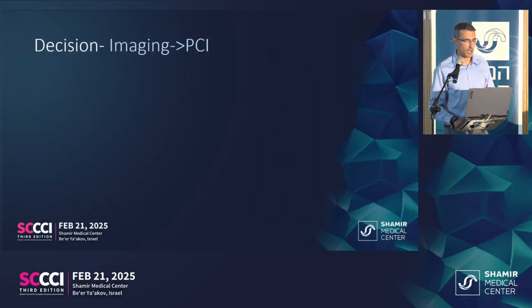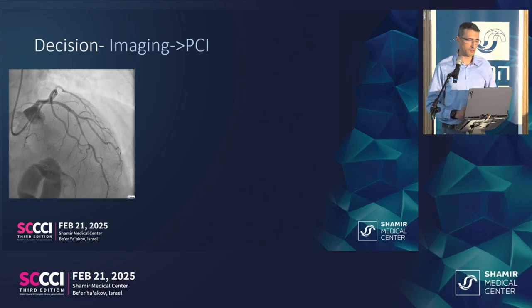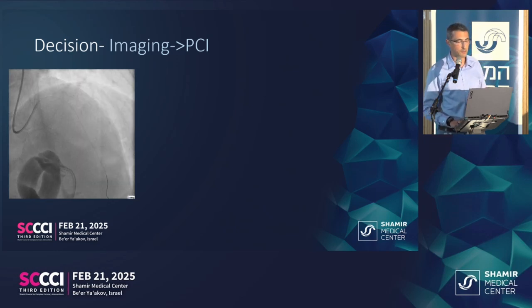And this is why I have good friends. And nitro? This is why I have bad friends. The bad friend is sitting outside, saying, give some nitro. I'm giving some nitro. It does improve, but still there is a lesion. Remember, the patient presented with non-STEMI.